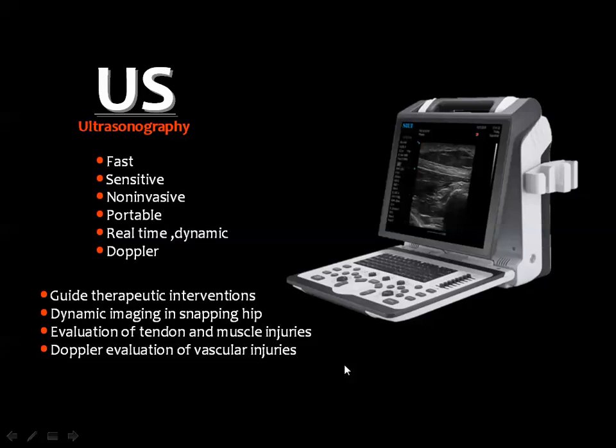Of course, you know that ultrasound has many advantages over most of the imaging techniques, including that it is a fast procedure, very sensitive technique, and non-invasive, using no ionizing radiation.